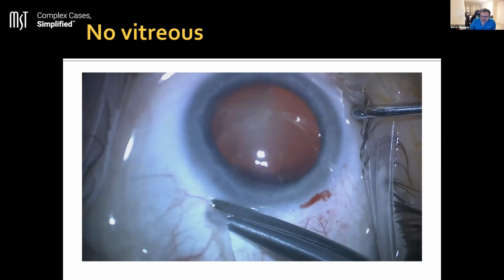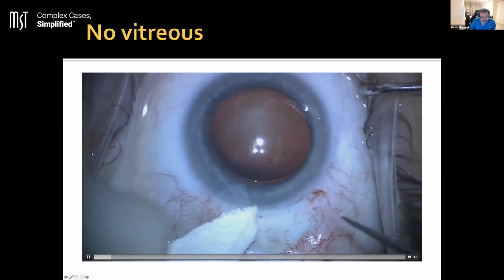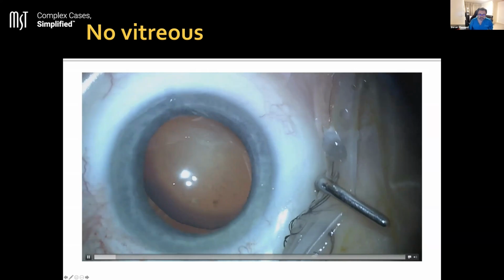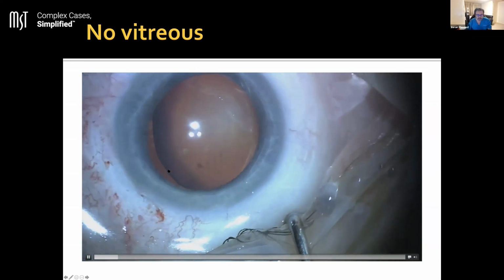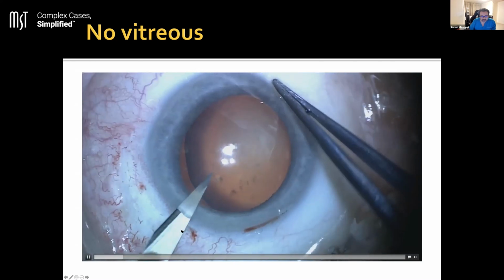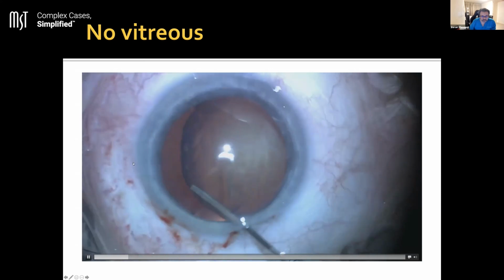This is a monocular patient, and actually she's in her 40s, and therefore a better approach would be to do this from the anterior segment, because actually there is no vitreous in the anterior chamber, and you don't have to worry about any vitreous coming forward, really, if you're careful and you adhere to principles.